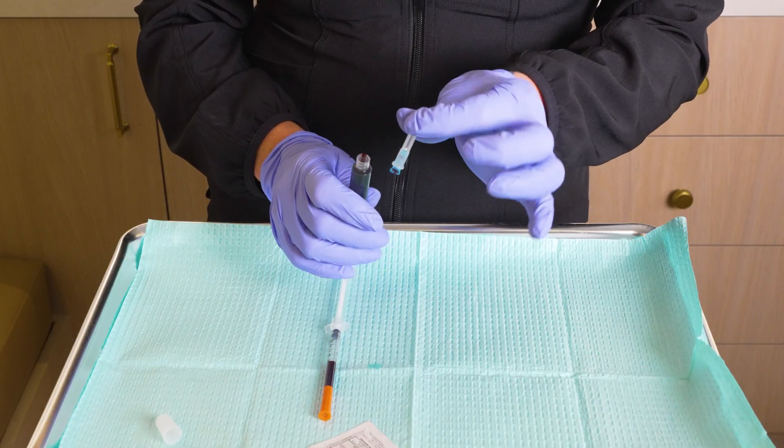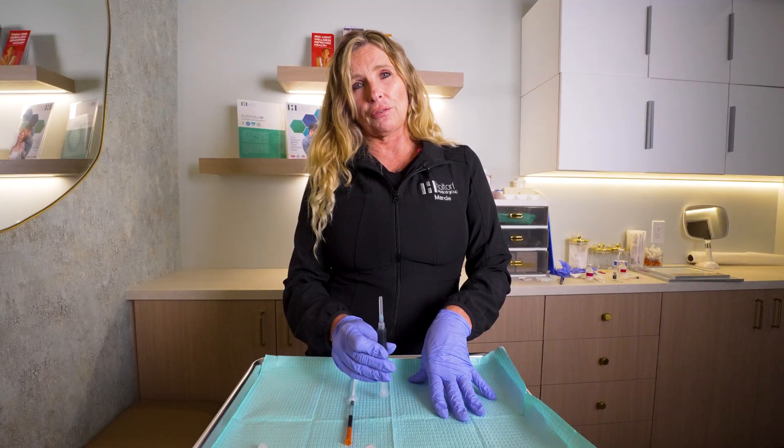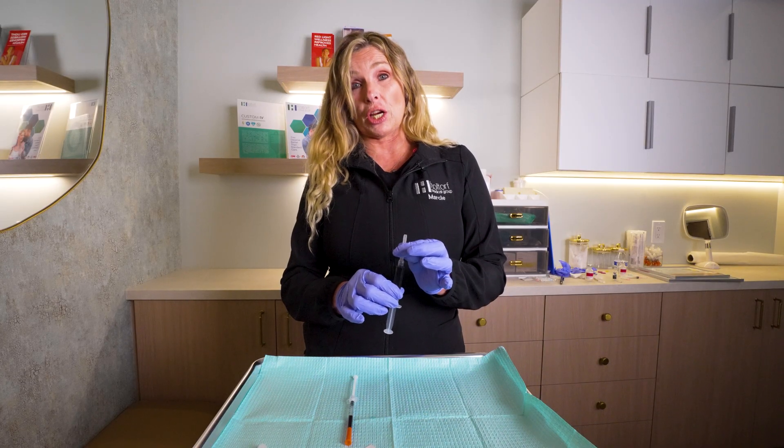So you'll just take your needle, remove the cap that comes on the syringe, and affix the needle, and it's ready for injection. This is an intramuscular injection, so we'll go over how to give ourselves an intramuscular injection today.